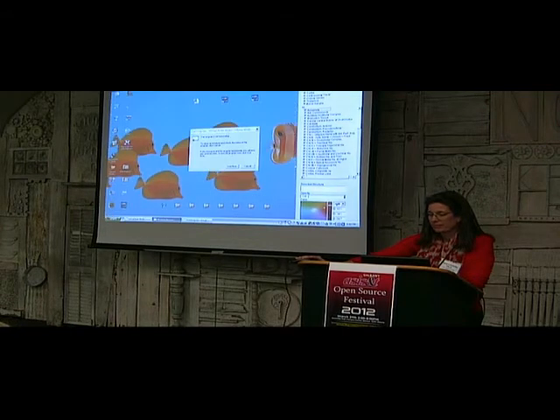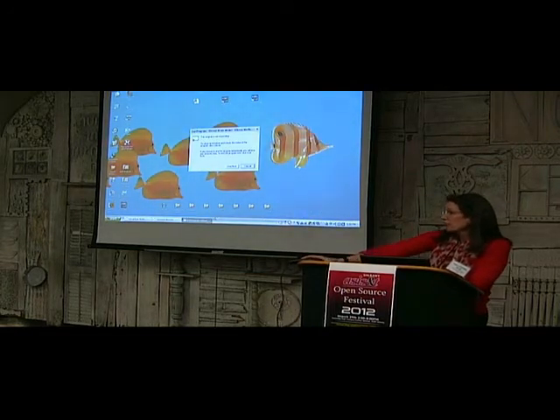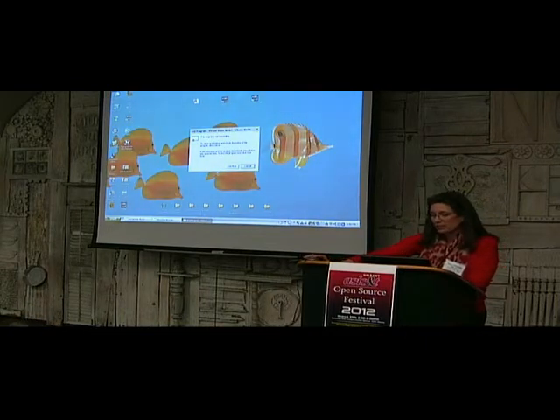Is the software used diagnostically? No, it's not. There are other 3D rendering software that's used clinically. They don't have this kind of ability to delineate structures that can't be viewed on an MRI. That's really the power of this, is that we needed to be able to see things that you really just could not see otherwise.